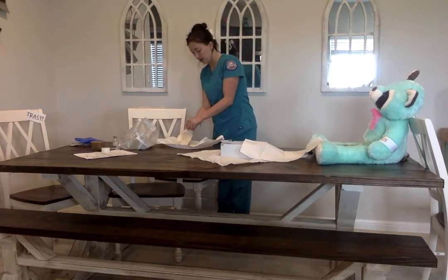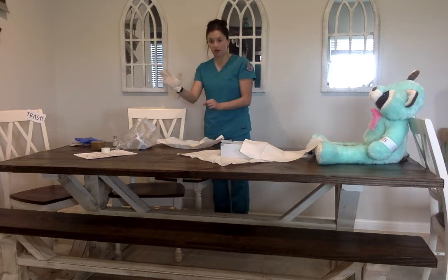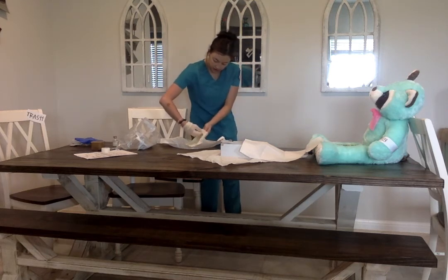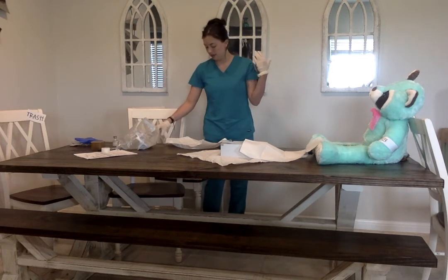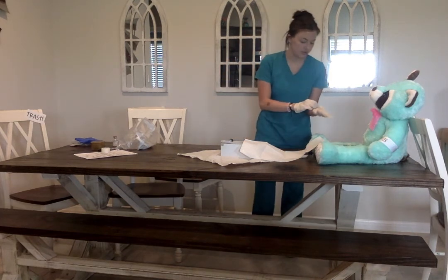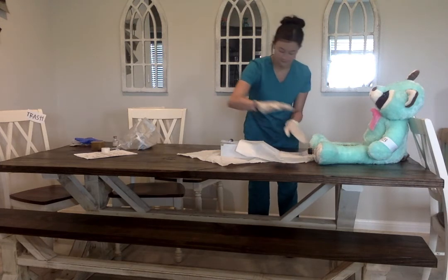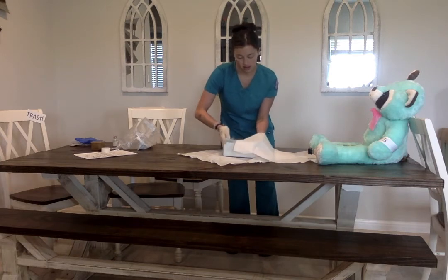And putting my hand in. Wiggling my fingers in my hand. Now going under this cuff, I'm going to put my hand in like this. Great, just like that. Trash. Okay, so now that I have sterile gloves on, I'm going to push this down in here and just make a better sterile field.